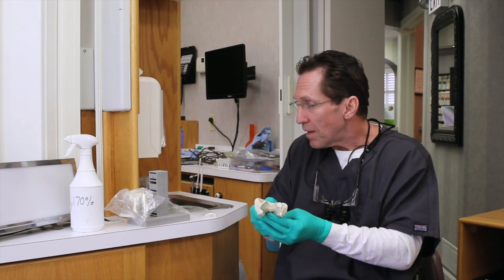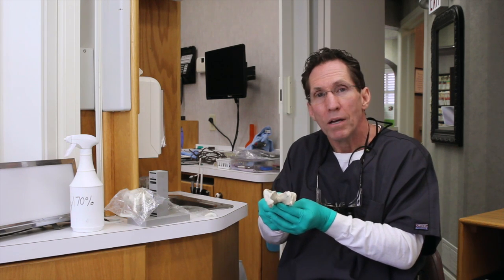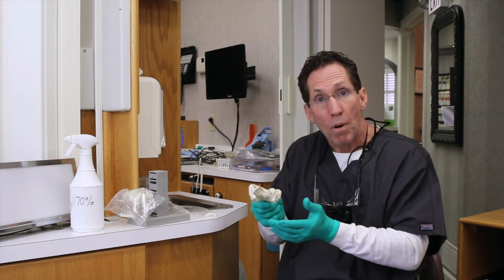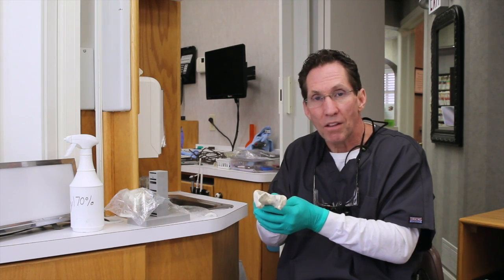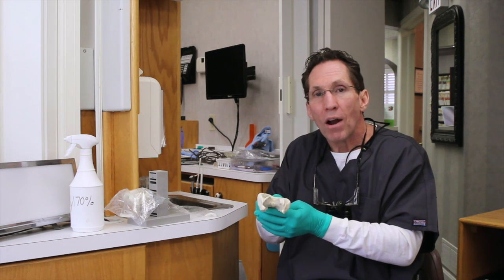But anyways, with that, the next question becomes one of how do we store this, and how long can we store this before actually pouring? Well, different impression materials, different alginate brands have different times before they begin to distort. My personal rule with the gel tray in our office is 10 minutes. And that may sound impossible or impractical, but we really stick to that rule. I will tell you that I would certainly recommend not going over half an hour.